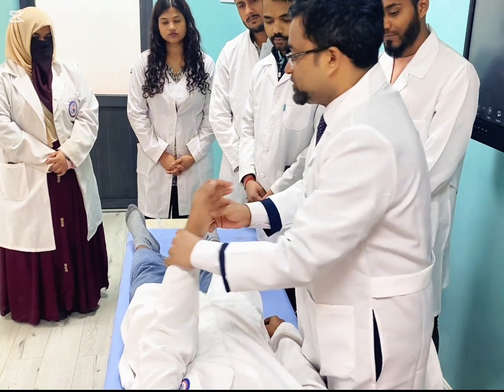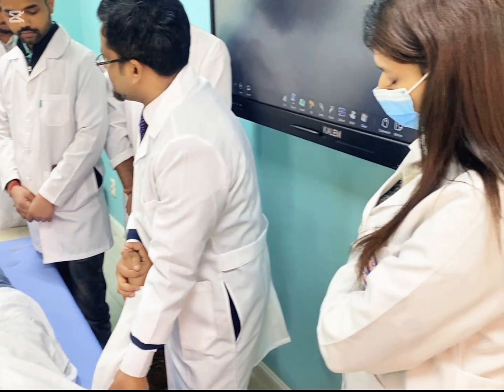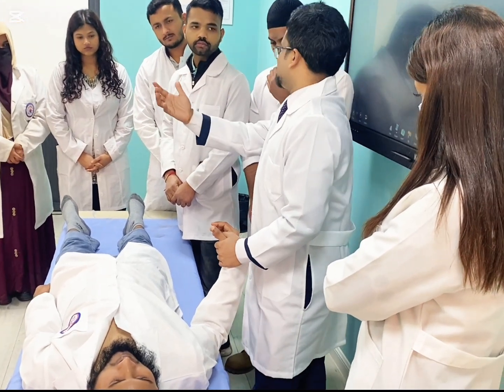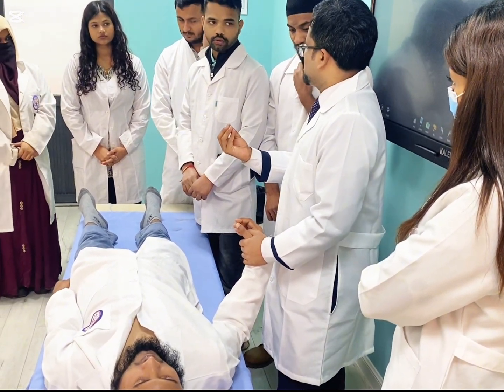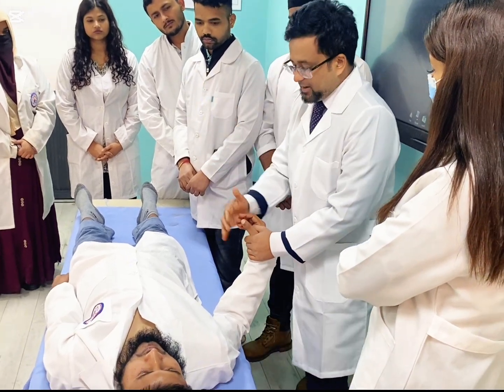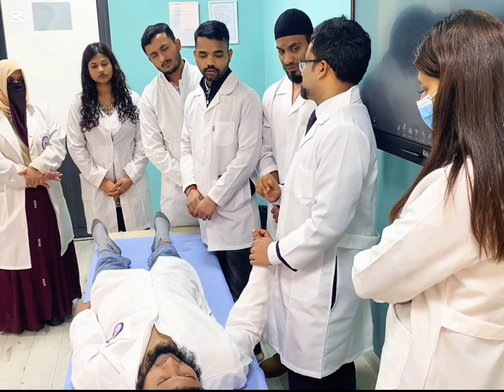Am I clear? We can do it normally without checking the pulse. But if you check exactly when the brachial pulse disappears, it will be more accurate and you can understand how much to inflate the cuff. Normally if a patient has hypertension, suppose 200 millimeters of mercury, then you can understand, yes, I need to increase the cuff up to 220 or 250. You understand? By this way you know exactly how much to inflate the cuff. When it starts beating, this is systolic. When it disappears, this is diastolic.